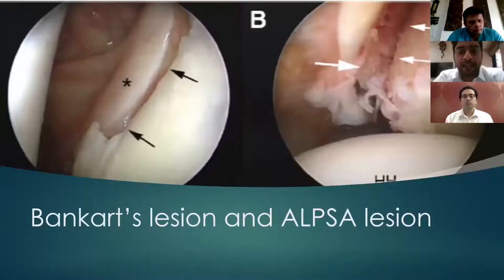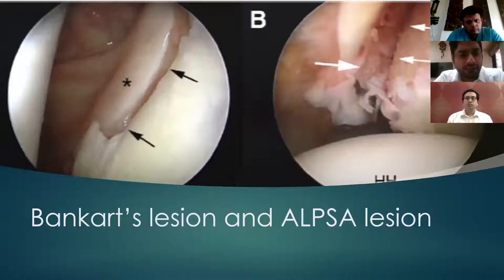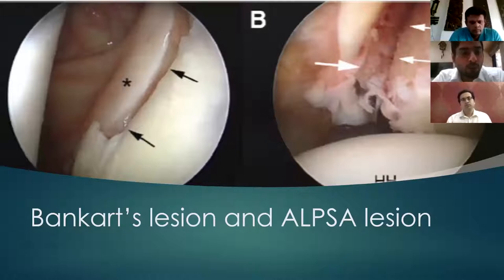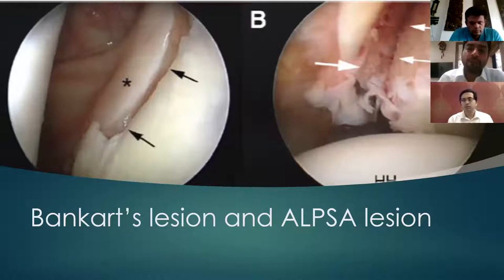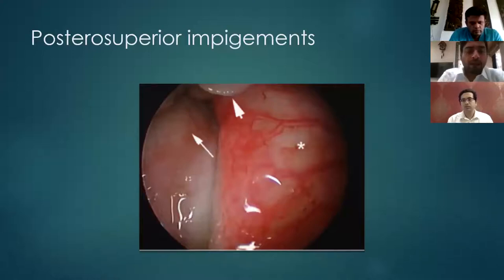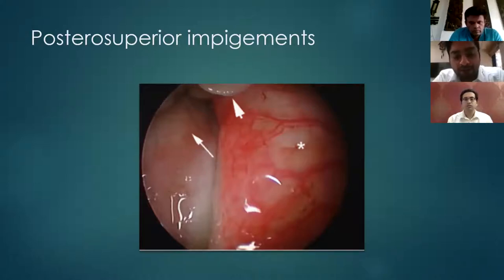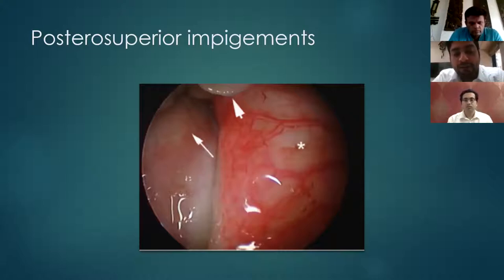The Bankart lesion shows labral detachment inferior to the equator, a most likely cause of instability. Whereas ALPSA lesions — anterior labral ligamentous periosteal sleeve avulsions — occur where the labrum is torn and the IGHL is scarred to the medial glenoid neck, usually seen in cases of multiple dislocations. In posterior superior impingement, the arthroscopic picture shows hypervascularity of the labrum and small cartilaginous defects at the supraspinatus insertion, with articular-side fraying of the supraspinatus tendon.